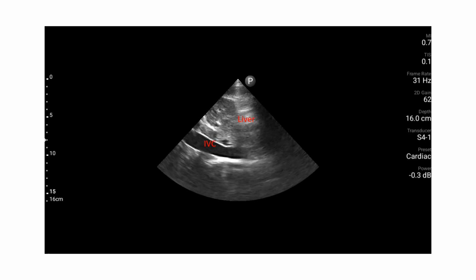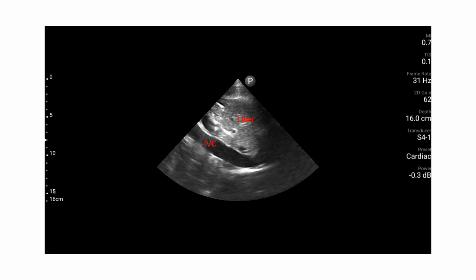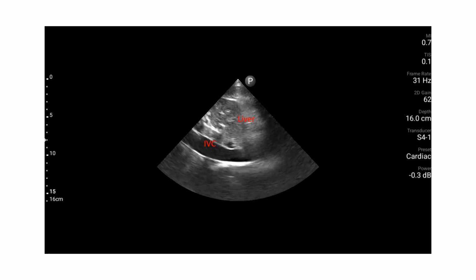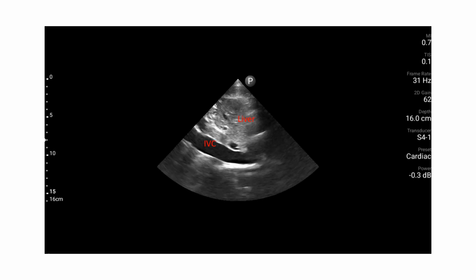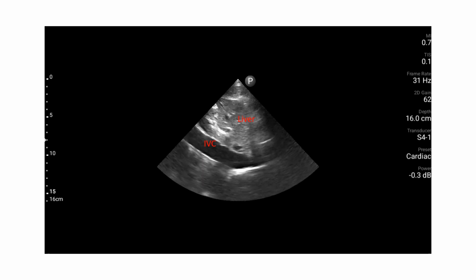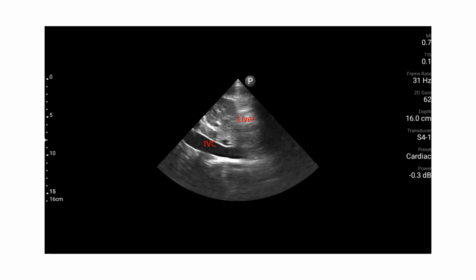So if the IVC did not collapse by that much, that would be predictive of a distended IVC, or if it was greater than a certain measurement. And if it collapsed by more than that, that would tell you that your CVP is on the low end of normal or low.